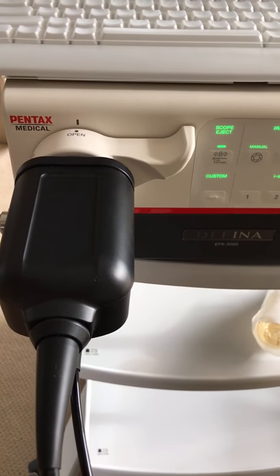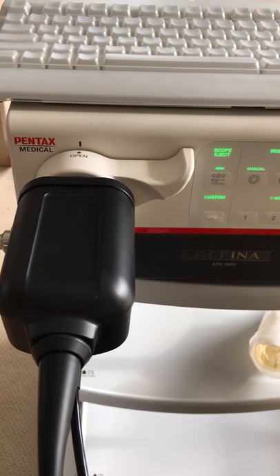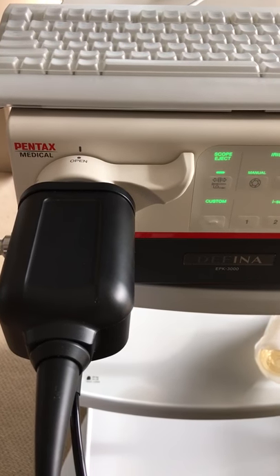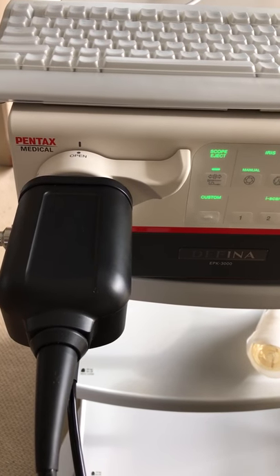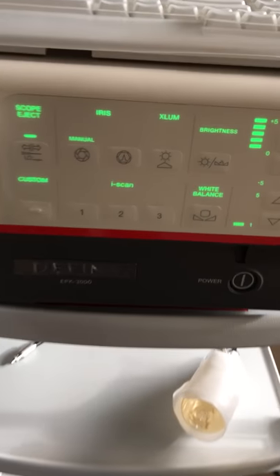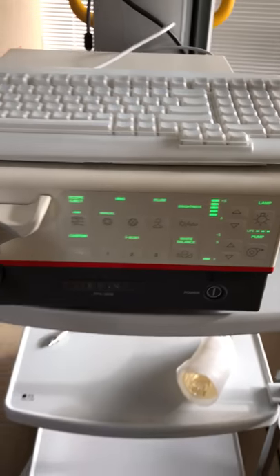Hi, Josh Nath here from JR Medical based in Auckland, New Zealand. I am the Pentax Medical ENT distributor here. What we have in front of us is the Pentax Medical EPK 3000 DEFINA.